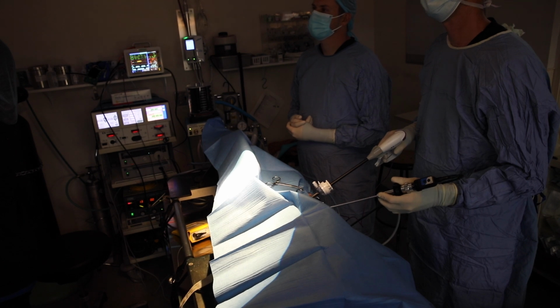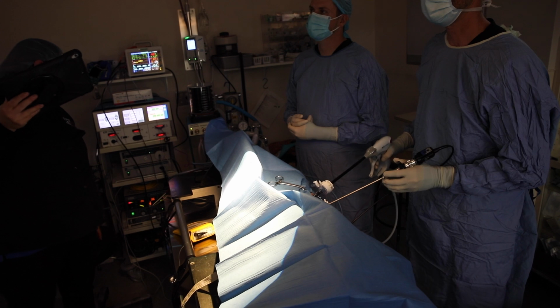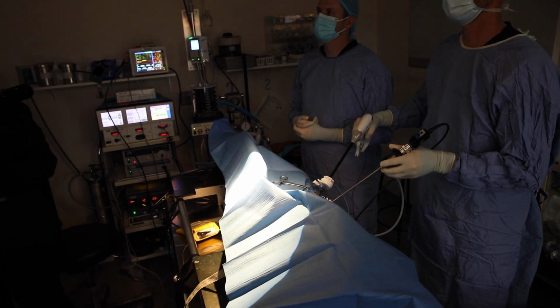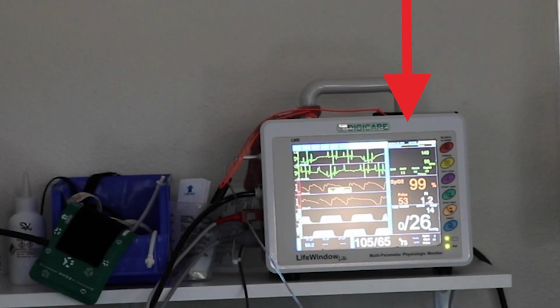intently. The other thing that you'll see there in that video is there'll be a couple of pans over to the ECG. That's the heart rate. And you can see that heart rate stays very steady throughout the procedure. And many times with the standard spay, once you start to pull and tug on that ovary, that heart rate will increase. And that's an indication of some pain.